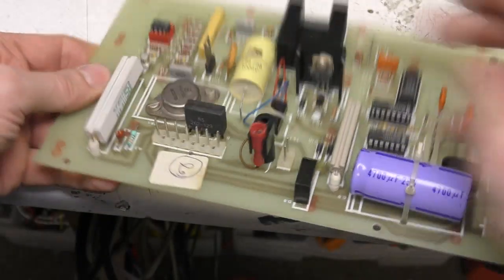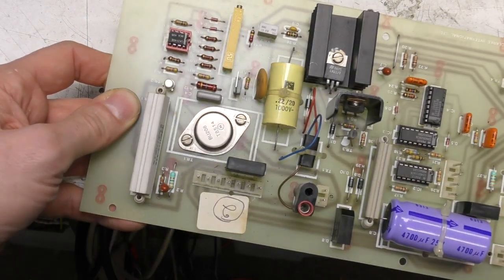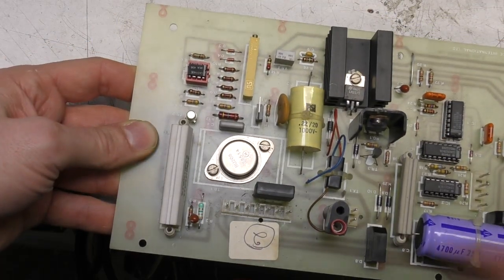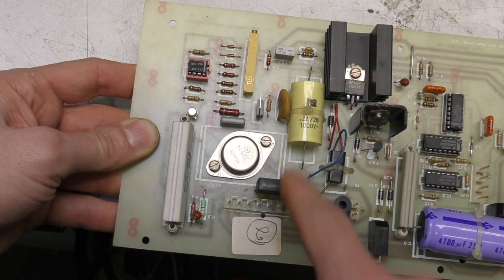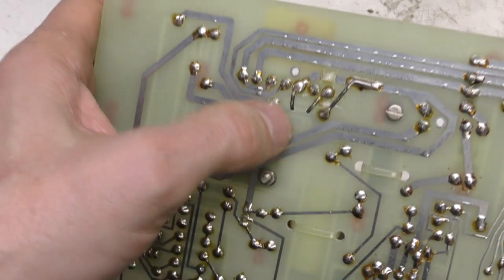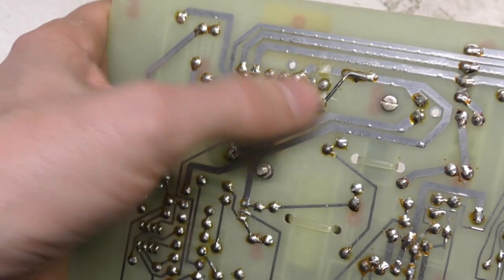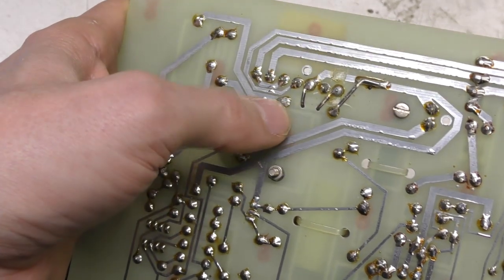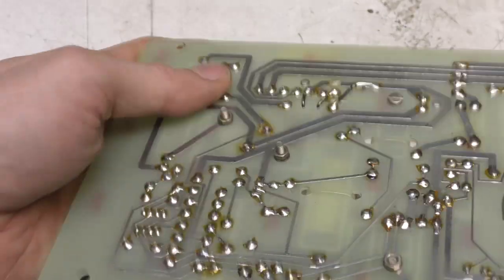There's a couple of regulators. I think these may be for the dimming of that chart lamp, the dimming control on that. And the rest of this is the high voltage system for the flash. And this looks a little bit unusual. There's a few little bodge wires here. Not quite sure. I think it looks like maybe they used a half wave rectifier and then changed to a full wave bridge, just judging by where the holes are and the additional connections in there.